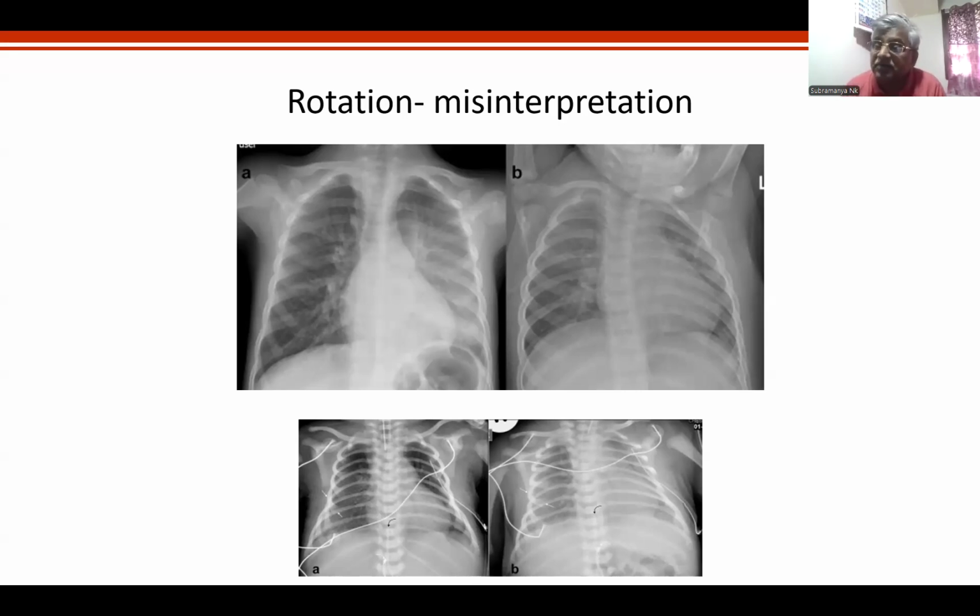Did you understand what I meant by rotation? Rotation, you think of 360-degree rotation, not just 180 degrees. In that, there will be various problems related to interpretation. Did you all understand? Please type U.